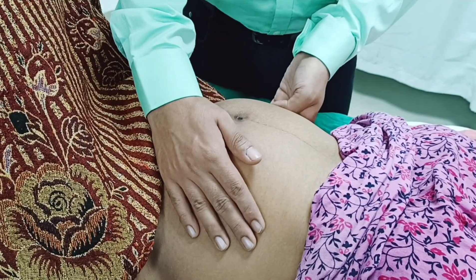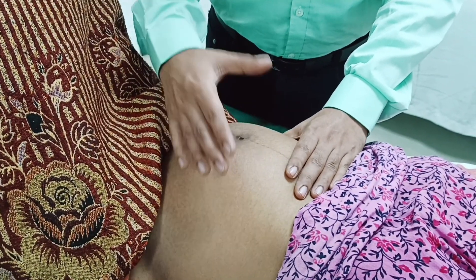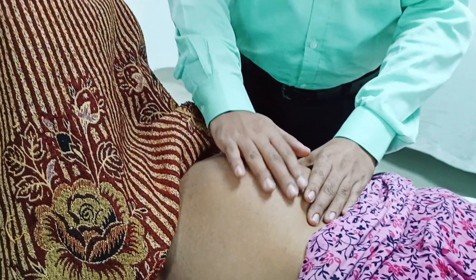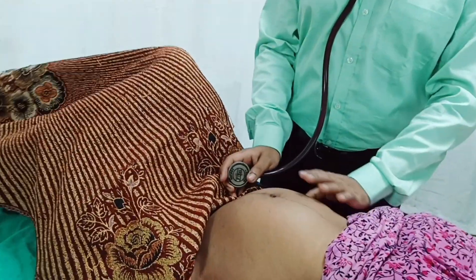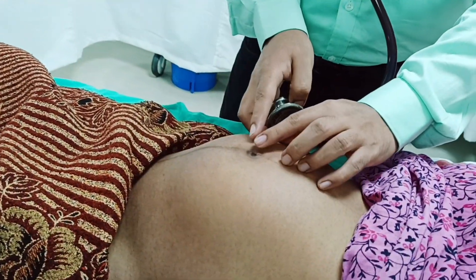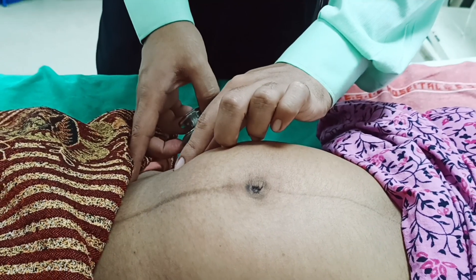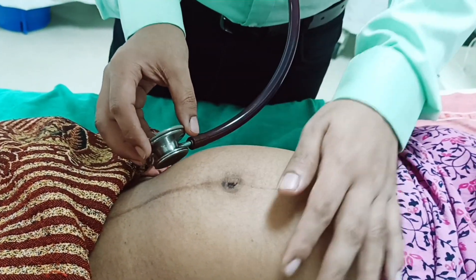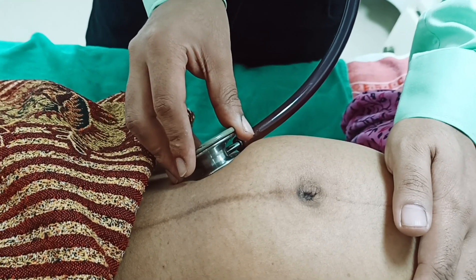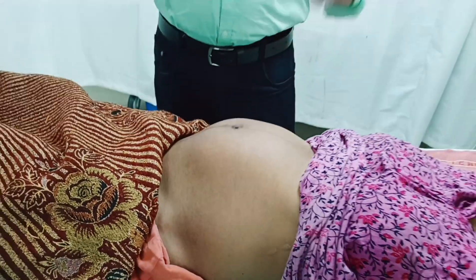For liquor estimation, it is the clinical expertise of the examiner — if you feel the fetal parts more superficially, liquor seems to be reduced; if you are not able to find fetal parts, liquor seems to be increased, that is polyhydramnios. For auscultation, since I had already felt the fetal back on the right-hand side, we identify a point on the spino-umbilical line at the junction of 2/3 medial and 1/3 lateral. At that point, with the bell of the stethoscope, we auscultate the fetal heart. Normal fetal heart rate is between 110 to 160 beats per minute. This completes the obstetric examination which we routinely do in all patients.